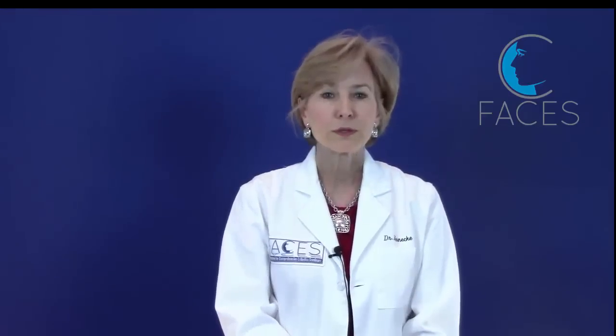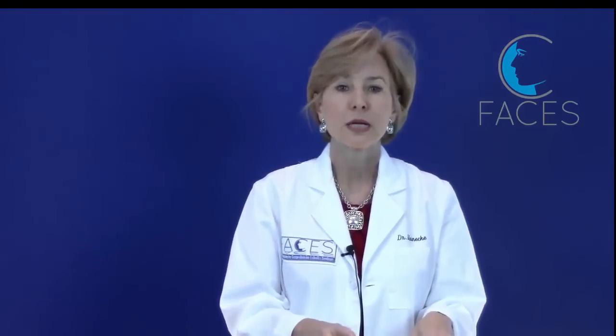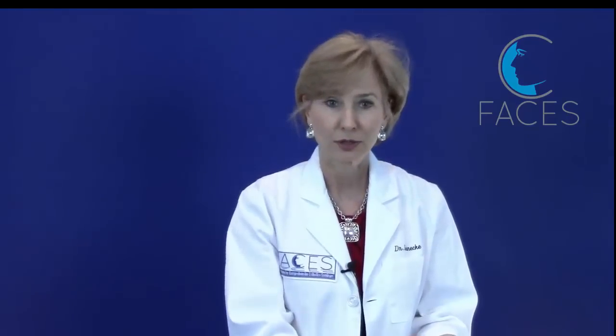Let's discuss another concept that practitioners who don't typically use multi-dose vials may not be familiar with: the prevention of the formation of a vacuum in a sealed vial. A vacuum will form in a vial if you don't replace the liquid volume you're removing with an equal volume of air. For example, if I need 2 cc's of saline, before pulling the liquid out I need to provide positive pressure inside the bottle. I do this by first injecting 2 cc's of air — equal to the volume I want to take out. Be careful not to inject the air into the liquid, so don't have the bottle inverted when injecting the air, as that creates bubbles and makes the volume more difficult to draw out.